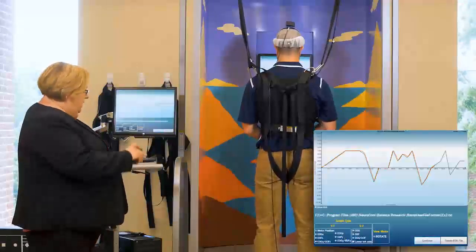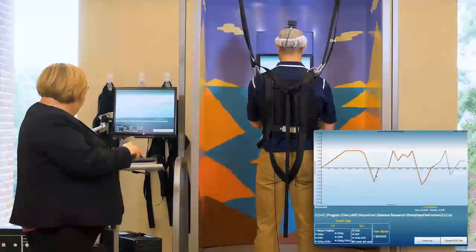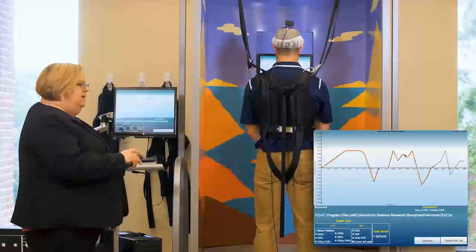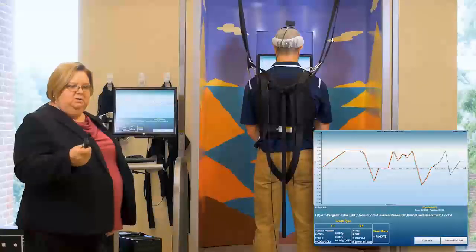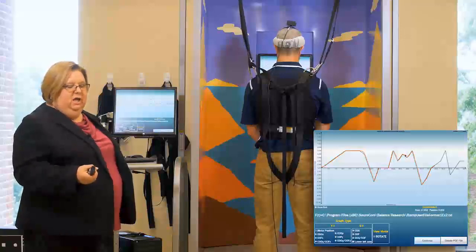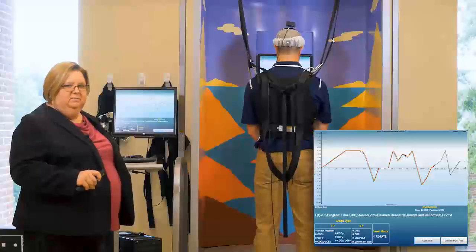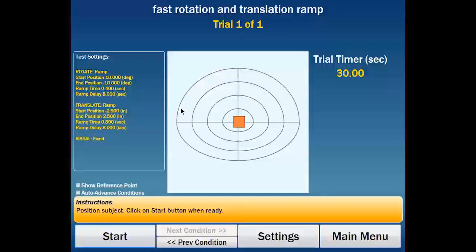And now you see that it's on, the motors and the position are actually right on top of each other. And so it's really kept to being true to the position, even though it has to sacrifice a little bit of the velocity.